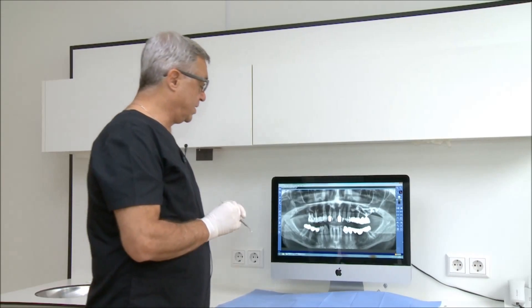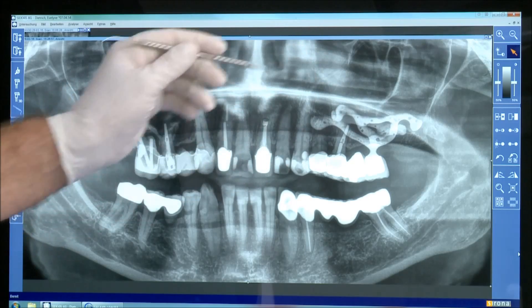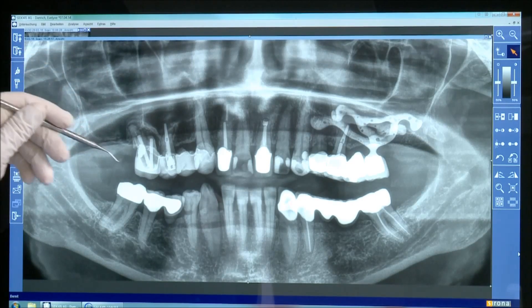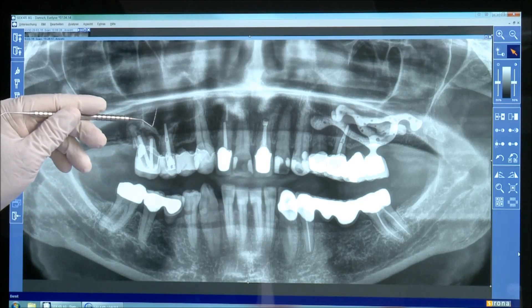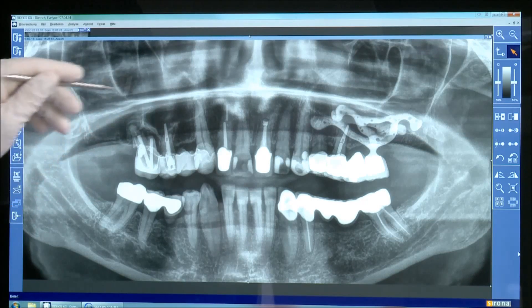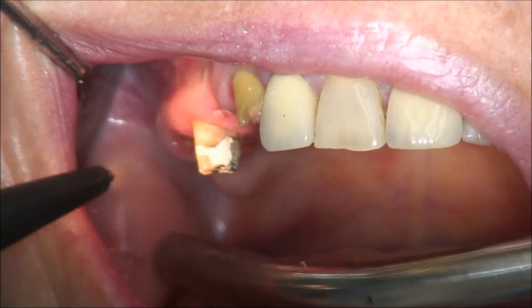This is the next surgery. In this special case, more than 20 years ago, a subperiosteal implant was placed, which is still in function. This time the surgery will be a sinus elevation on the right side with implant insertion in the first premolar area, second premolar area, and first molar. We will extract two teeth and fill the whole area with augmentation material, covering with a membrane.